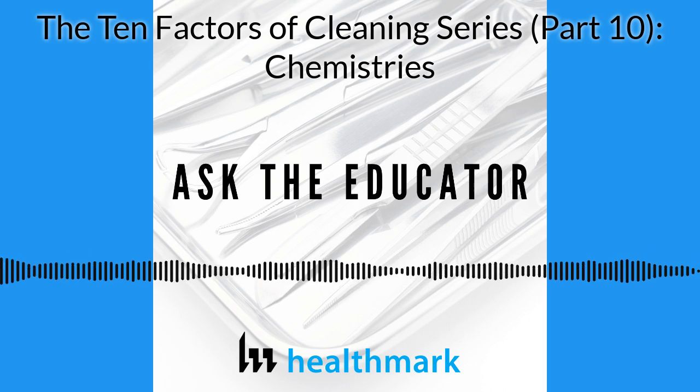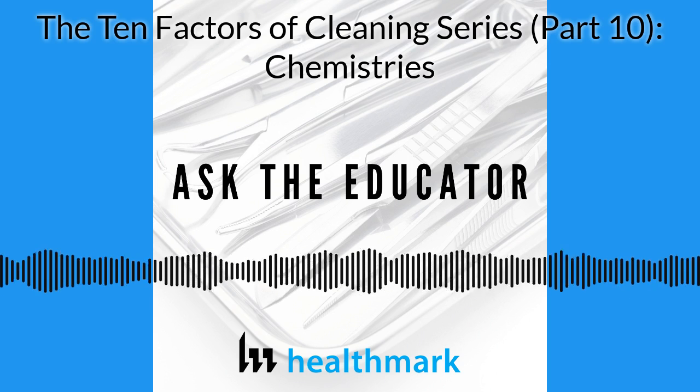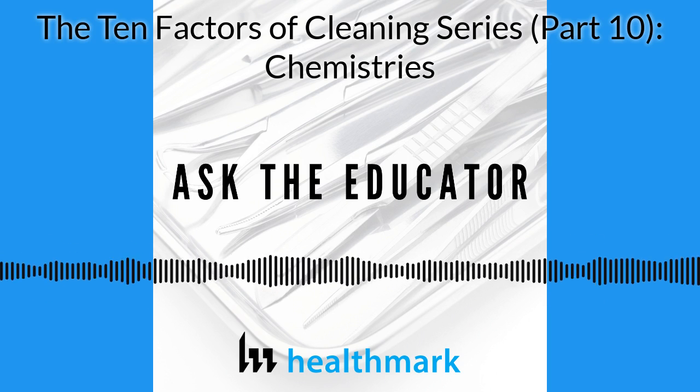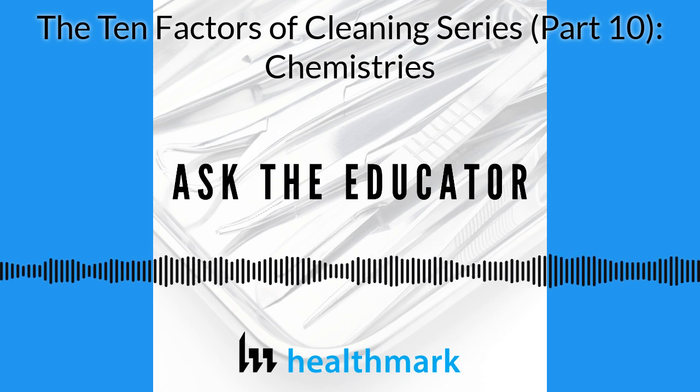That's true. So we didn't get really technical with people, but I'm glad you let me take this conversation to where we want to raise awareness of people. You alluded to it. Read the label. Know what that chemistry was that you used on the Durabond, and maybe it's only for a minute or two, and they let it soak for even 4 minutes or 5, and it ruined the instruments.